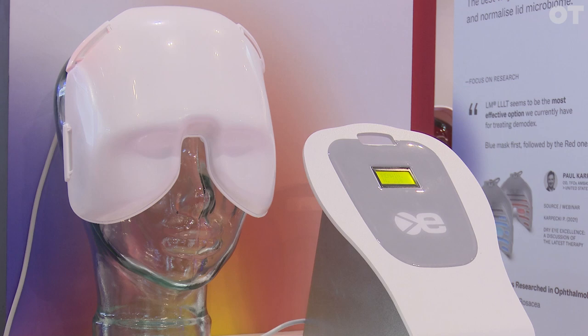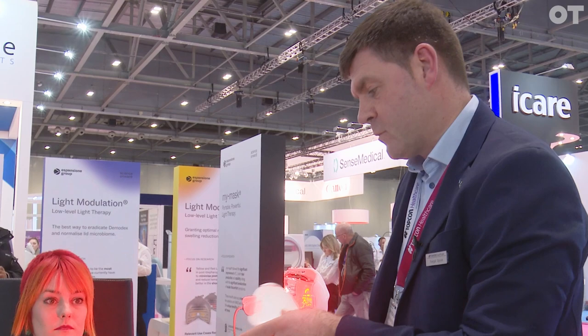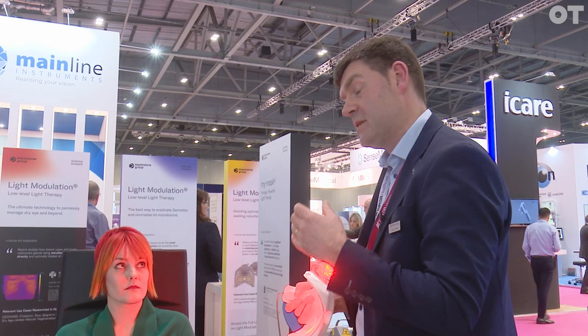To be able to treat the upper lid, we use what we call low-level light therapy, and to do that we apply a face mask for the patient. When we deliver low-level light therapy, we use this white mask with a series of red LEDs, and you can see from where the red LEDs are positioned that they're right over the lids. The patient will recline the chair in a nice, relaxed position. There'll be an intensity of heat felt by the patient, but it won't be delivered from the mask — it'll be delivered from an internal heat reaction of the patient's cells to the wavelength of light. Unlike IPL, which is a hot thermal flash, this is heat generated from within the patient's own cells — an endogenous heat reaction.